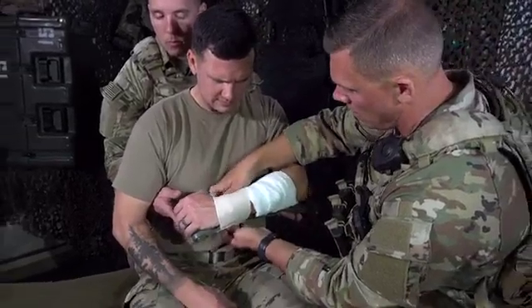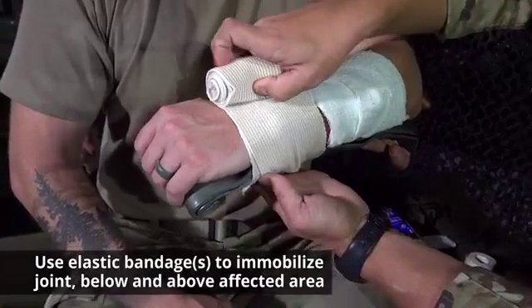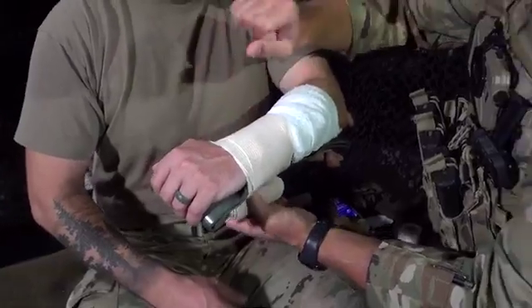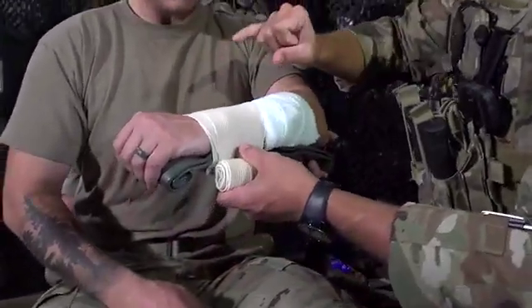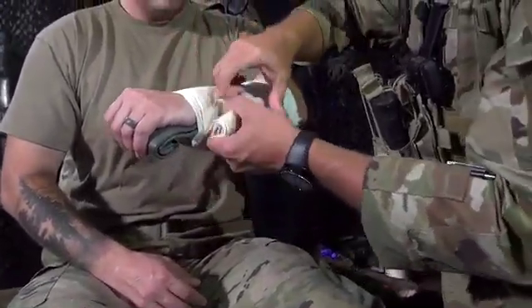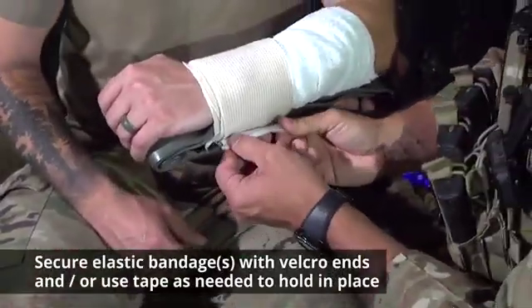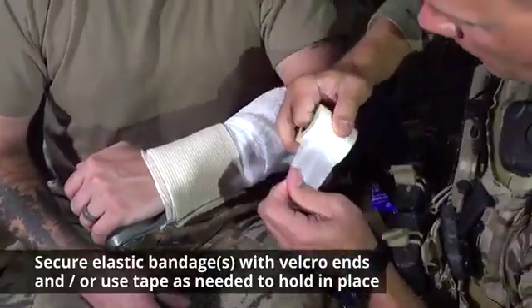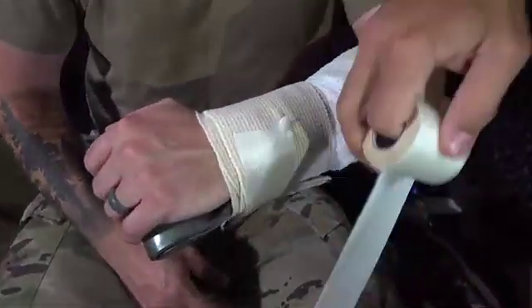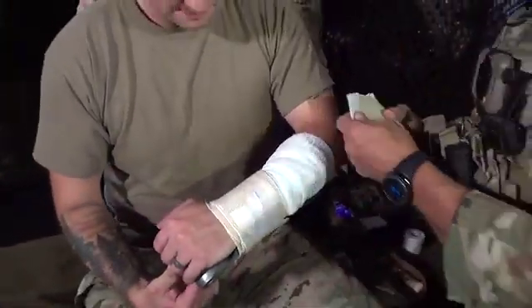Hold that in place as best you can. Using the elastic bandage, we want to immobilize the joint below as well as the joint above the affected area. The reason for that is when he twists his wrist or moves his elbow, those two bones in the forearm will move as well, further causing pain and potentially more harm. We'll secure with the velcro ends and then add a bit of tape.